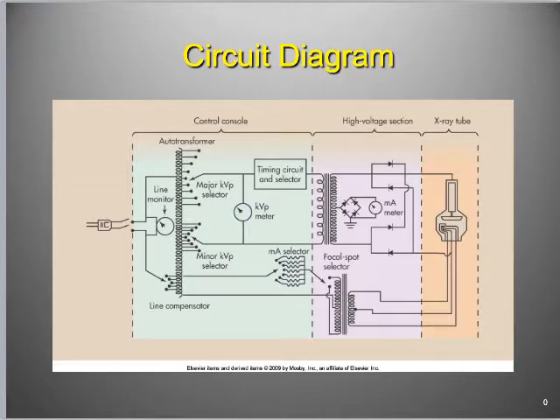One of the last things that we've got here is an MA meter, right? That's where he's located it, at least, and that's where it's commonly drawn, on some side of the high voltage section. I'm not really exactly sure why. I probably should know why, but that's just generally where it's placed. Sorry.